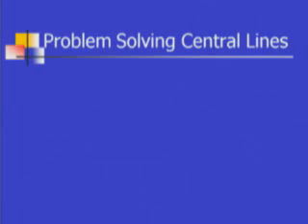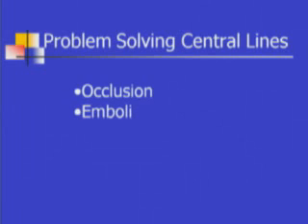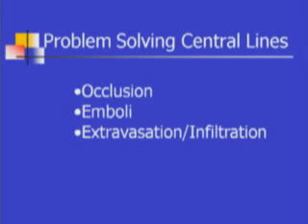Problems can occur frequently with an access device. These problems are often serious medical events and need to be immediately identified and addressed. Problems most often associated with access devices are occlusion, emboli, extravasation or infiltration, phlebitis, and infection.